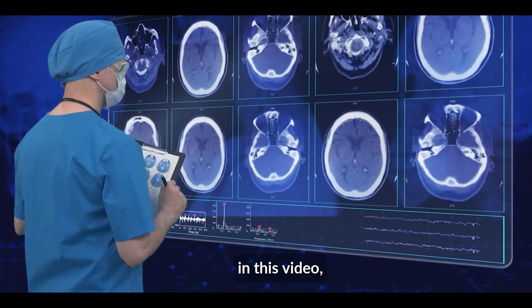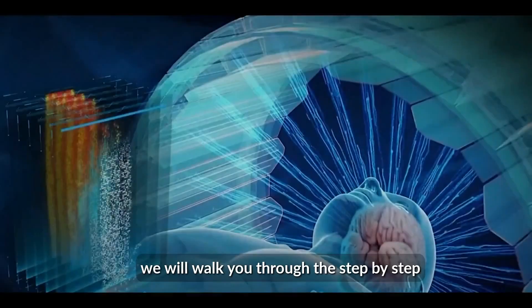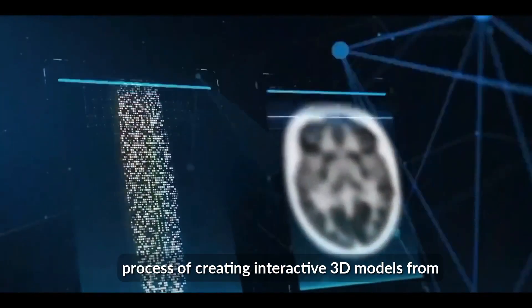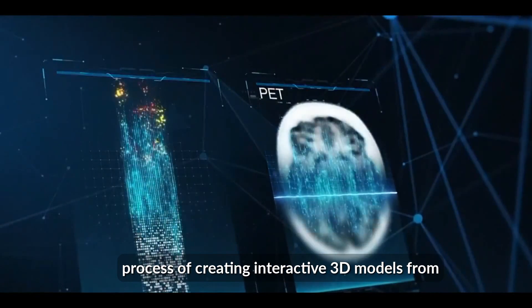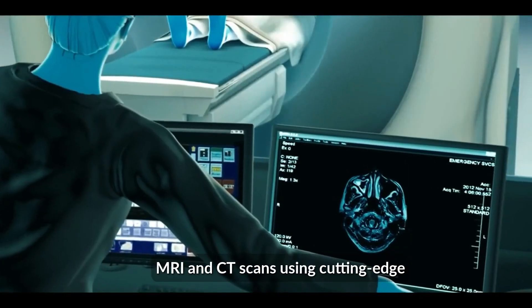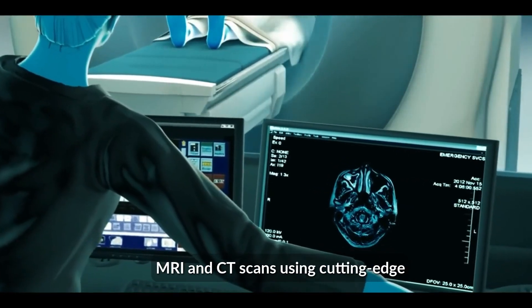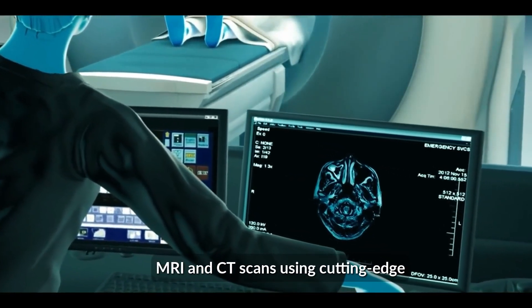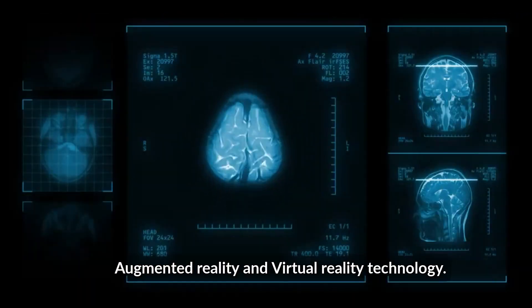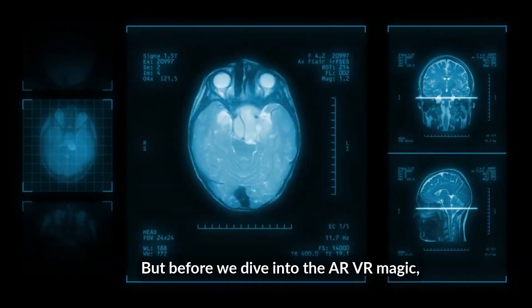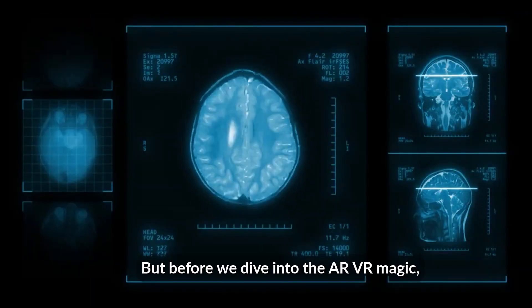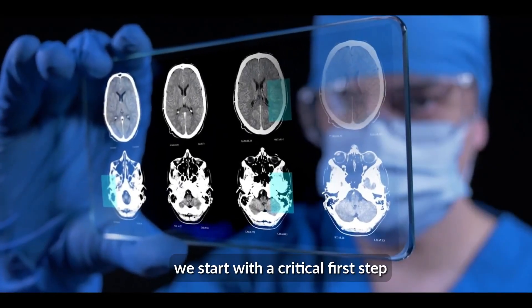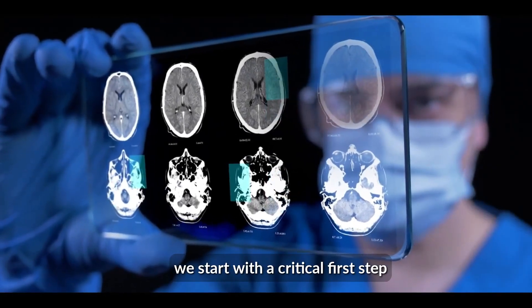In this video, we will walk you through the step-by-step process of creating interactive 3D models from MRI and CT scans using cutting edge augmented reality and virtual reality technology. But before we dive into the AR VR magic, we start with a critical first step.